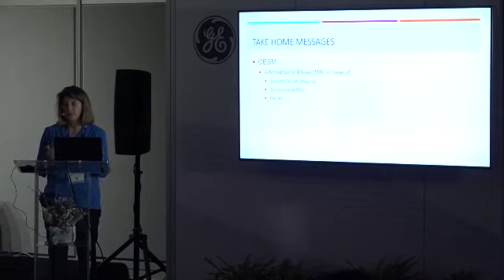Also, I think this is a possibility to do everything in one day. In my institution, we developed the one-stop clinic where we try to do everything for diagnosis in one day. It's a post-screening assessment. We developed a lot of these new technologies such as tomosynthesis, contrast mammography, and all kinds of biopsy, to do everything in one stop to make the best diagnosis in one day.